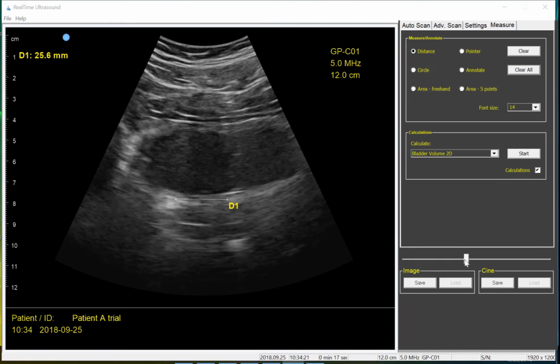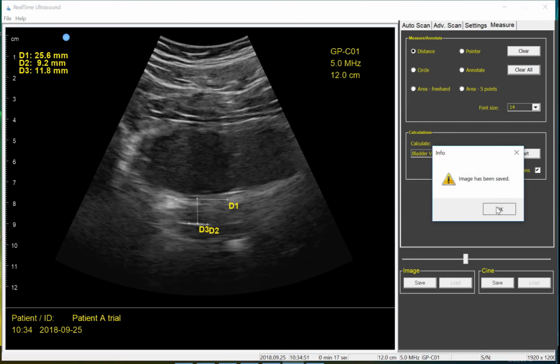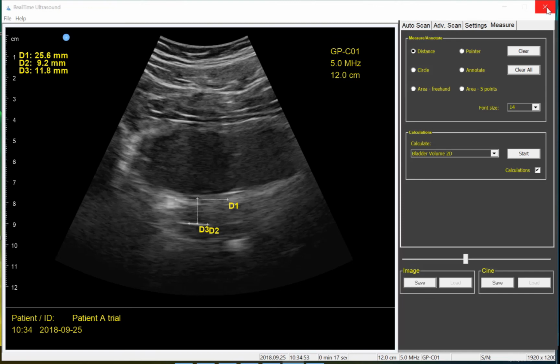Don't try to catch the patient mid-contraction. Have them do two or three good contractions, observe the quality that you're looking for, and then make your objective measurements using the cine feature. You can go frame by frame with the arrow keys to really dial it in, but I generally use the scroll bar. The most important thing is to find a good, consistent, reproducible landmark. I've shown you two examples here, but of course this can be used anywhere in the body, and it's great to reproduce or measure changes from session to session.